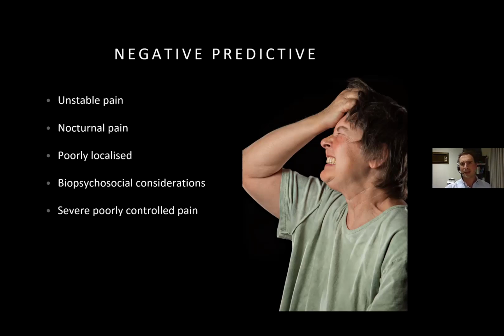Again, severe pain that's poorly localized, and poor tolerance to palpation. If with just very light pressure the patient can't tolerate it, they're not going to be able to tolerate the shockwave at that particular point. There are techniques that I use to desensitize patients so that they're ready.